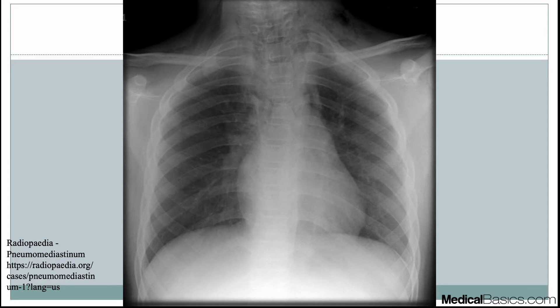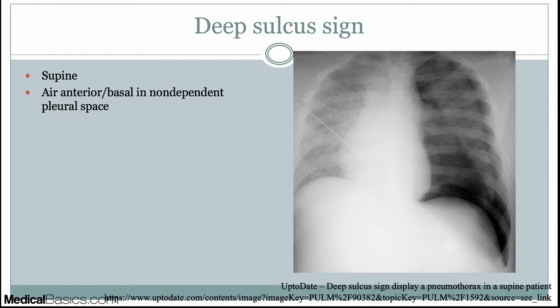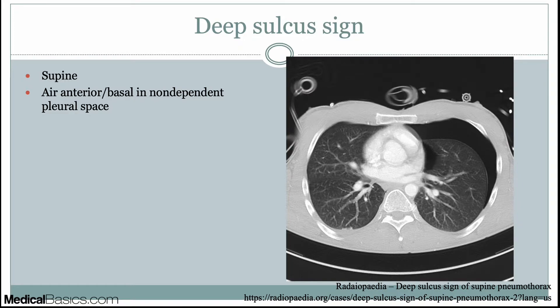This is called the deep sulcus sign — a very abnormal situation. When a patient is supine, air doesn't necessarily go to the apex; it goes in the most non-dependent direction, which when lying down is the anterior lower segment of the lung. On CT, since patients are supine with their back flat on the table, air goes anteriorly — that's why we see it up front, often in the lower lobe, where there's a deeper pocket for air to collect. On CT you just call it pneumothorax, not deep sulcus sign.